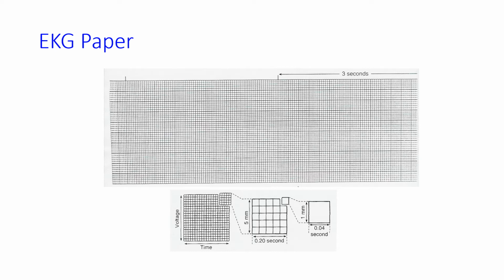Now, we measure time horizontally. Vertically, we measure voltage, which is up and down, and that's usually determined by the amount of muscle mass and also by effectiveness of surface electrodes as detected electrical activity. Such things that can change that are obesity, or the chest wall, such as in a barrel chest, which can make the tracings smaller.